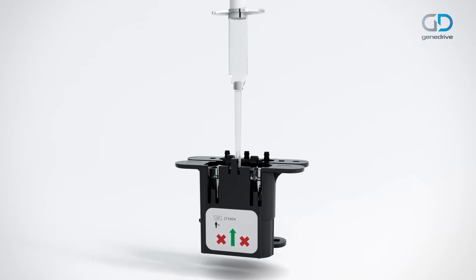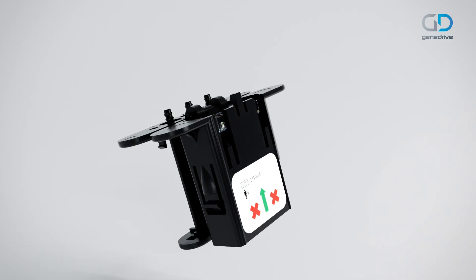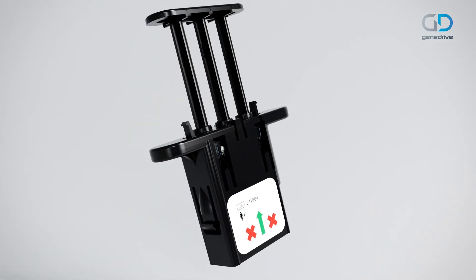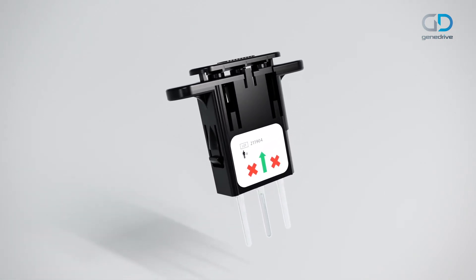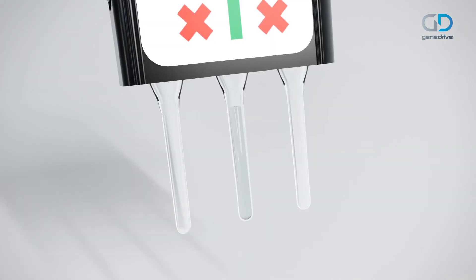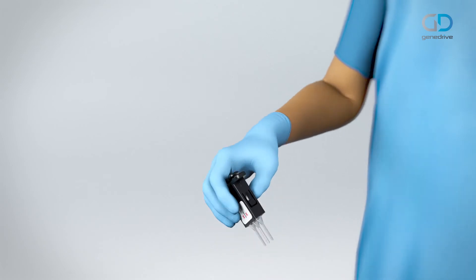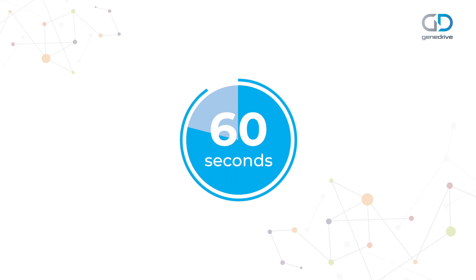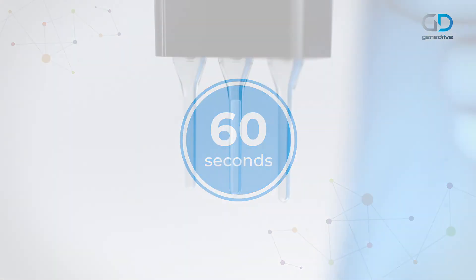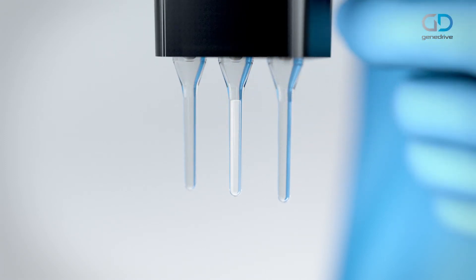Immediately dispense the buffer into the neck of the middle tube only by pressing down the piston on the Minivet. Close the cartridge lid assembly and fully depress the plunger until a click is heard, ensuring the clips on both sides are fully engaged and firmly locked. Check the level of liquid is correct — the correct fill level is important. Holding the lid, firmly flick the cartridge downwards to force the sample to the bottom of the middle channel. Leave for at least 60 seconds for the reagents to dissolve and fully reconstitute. If any bubbles are present, tap the tube with a finger flick motion to ensure the bubbles move to the top of the tube.